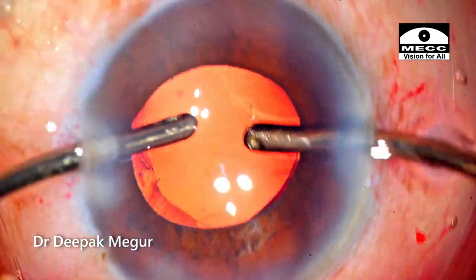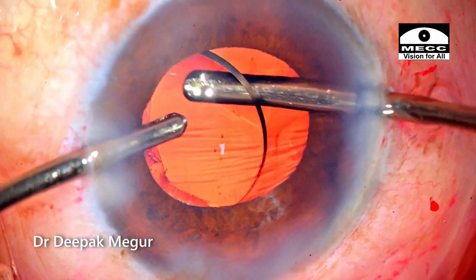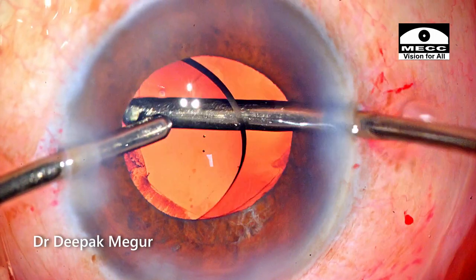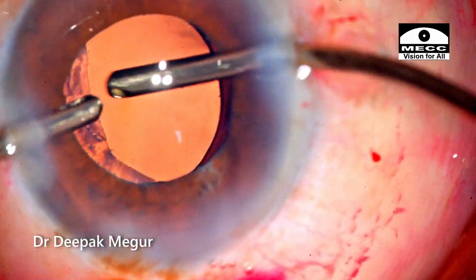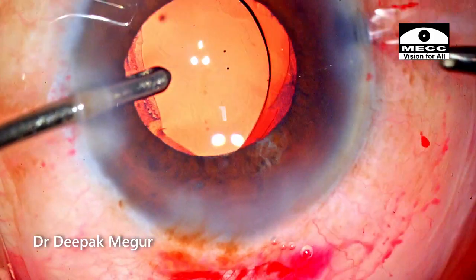But before that, I need to remove the OVD from behind the lens. So I go in with my bimanual I&A to remove the OVD, and since this is sodium hyaluronate, I'm using my aspiration port to aspirate the OVD underneath the lens. The idea is it just is a little quicker.